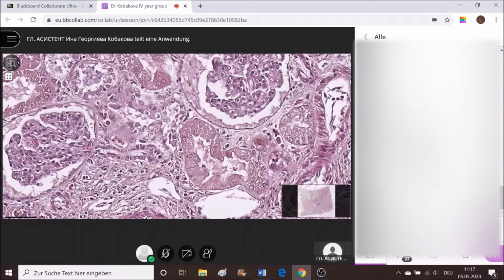It's looking granulated because there previously has been stasis, cellular edema, finally changes, finally lysis of the nucleus, karyolysis, and finally death of the whole proximal tubule, which is more appearing eosinophilic due to the disintegration of the organelles inside in the cytoplasm.